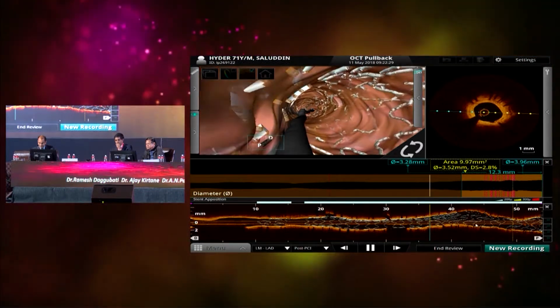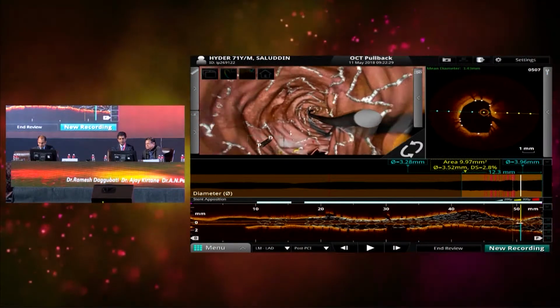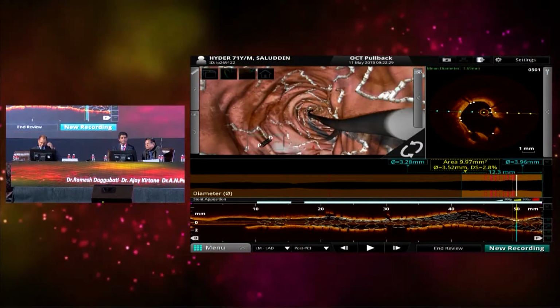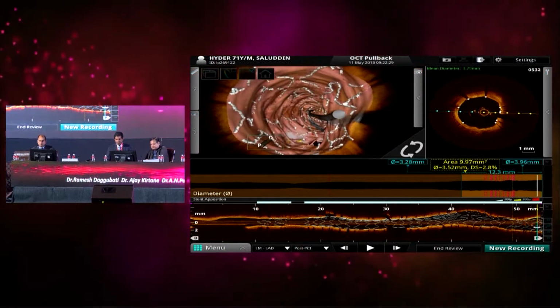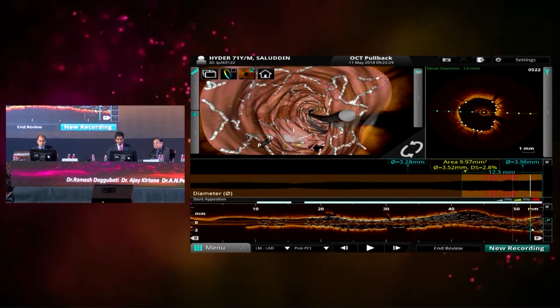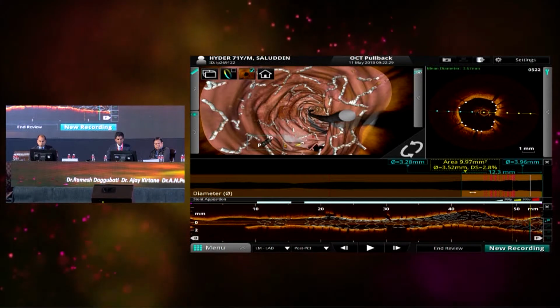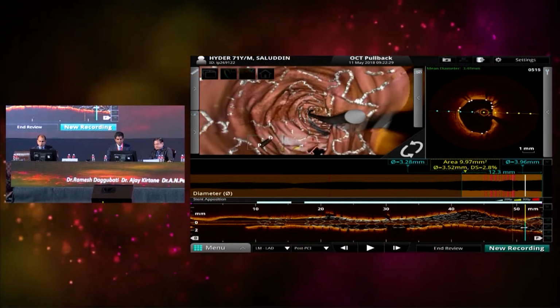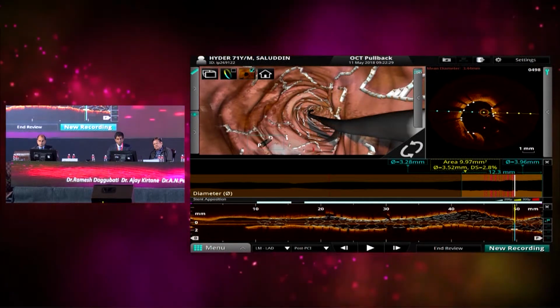Now the end of the left main is around 4.5 to 4.6, and the stent is well opposed, and angiographically the result looks very good. There is slight pinching of the ostium of the circumflex angiographically, but on OCT it's clear. So we didn't want to recross and do anything for the circumflex.